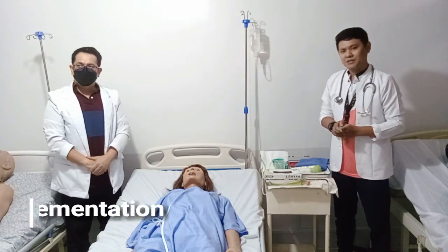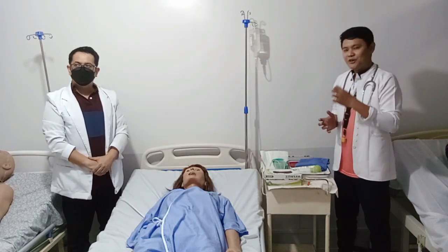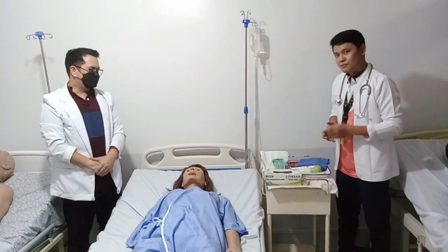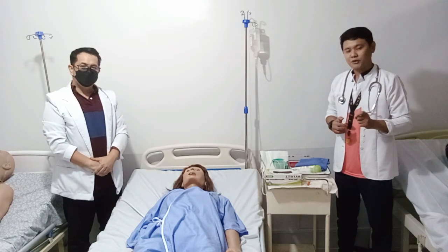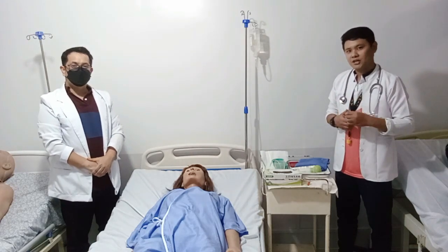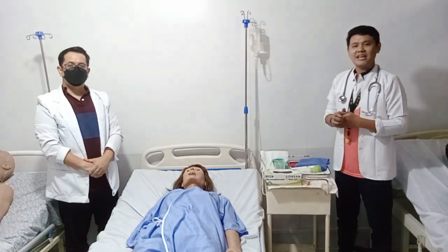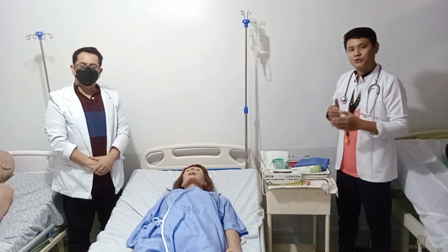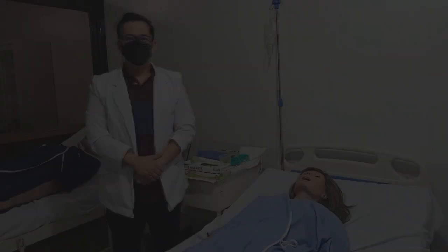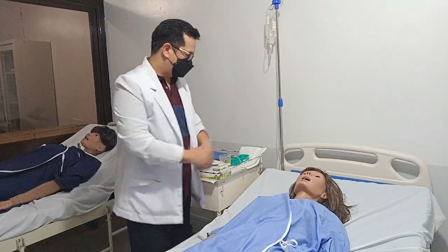Let's move on to the implementation. We're going to introduce ourselves and verify using the agency protocol: 'Hi, good day ma'am. I'm Johnny Longmeo and I will be your nurse for today.' Remember the agency protocol — check the name of the client by verifying the chart, the door tag, the bed tag, and even the IV tag. Explain the procedure to the client — what you're going to do and how the client will participate. Then position the client in a high Fowler's position if health conditions permit, and support the head with a pillow if appropriate.